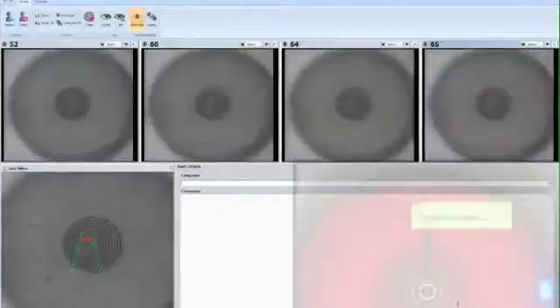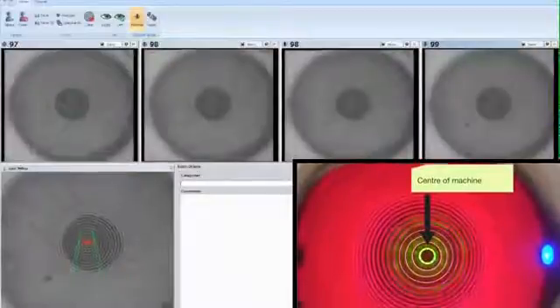Once we have achieved an ideal head position, we need to direct our attention toward the capture screen and look at the exact position of ocular fixation. The first example here shows the patient looking directly down the middle of the black dot in the middle of the camera.